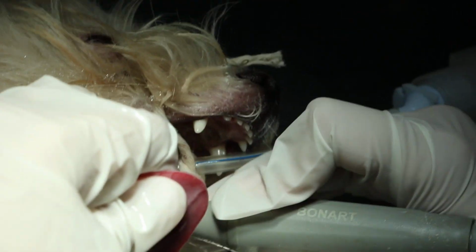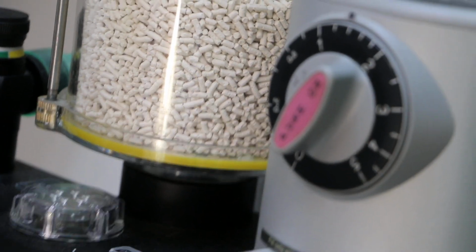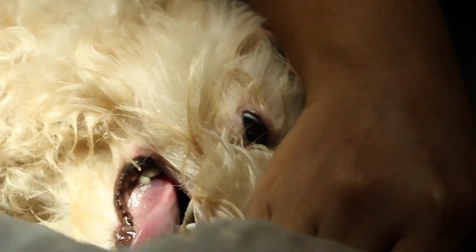The dog is okay. Get ready to turn over. Uncuff first. Get ready first. Okay, not ready yet. Okay, let me see here. Okay, put 1.5%, because this is not a very major surgery, so there's not much pain involved here. Okay, come. We turn over, uncuff, turn over, then I go that side, and that's it.